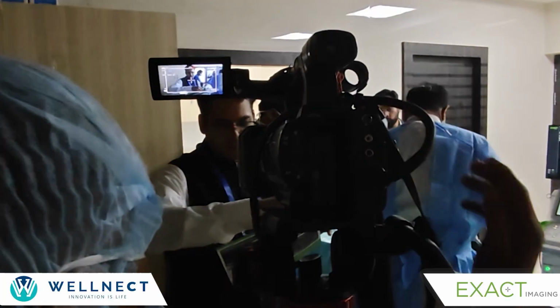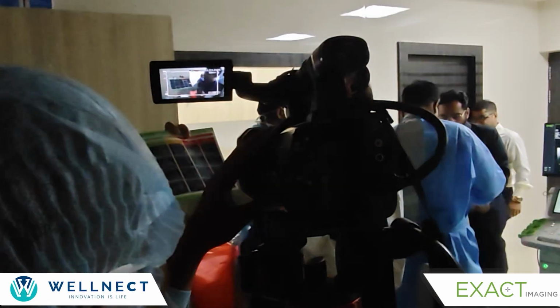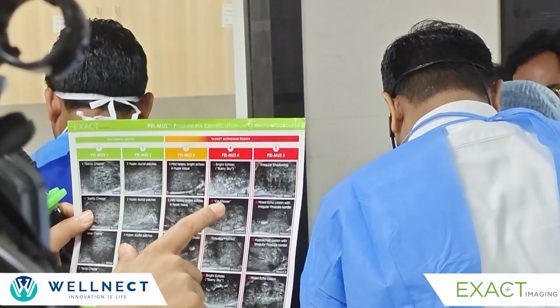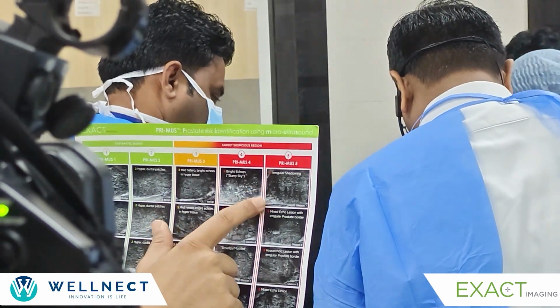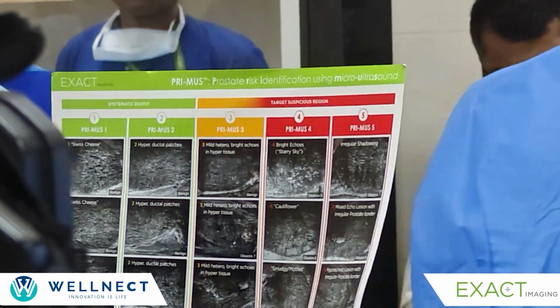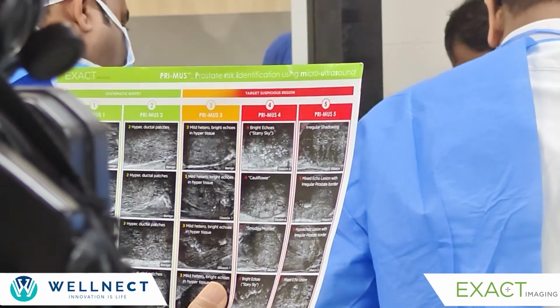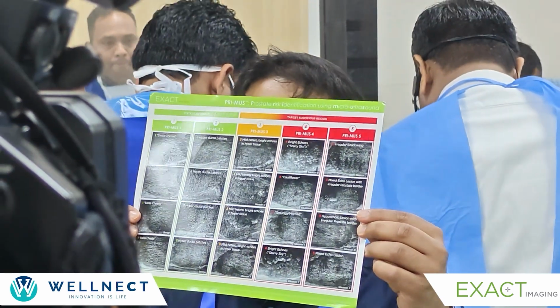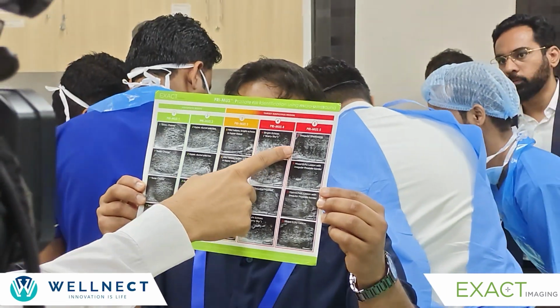So if you just focus on this, can you see this? Yes, sir, we can see that. You can see it now. Yes, sir, we can appreciate. So can you see the starry sky? Your voice is low. Can you see the starry sky? Yes, sir. PRIMUS 4. Yes, sir. Focus on this, we can see. So this is the image in this case. You can see the PRIMUS 4.